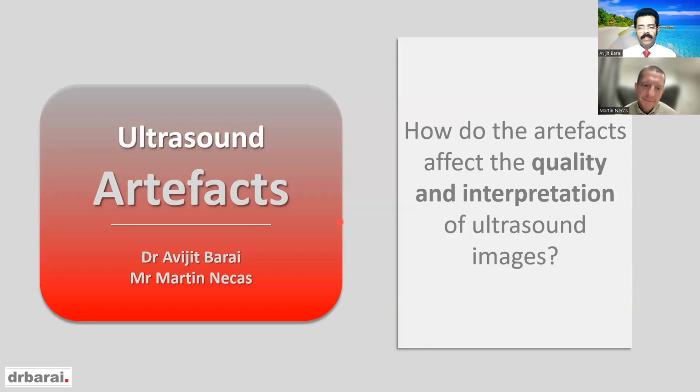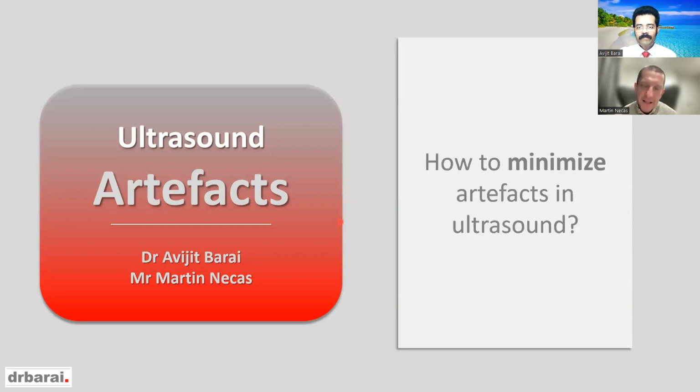So how do the artifacts affect the quality of an interpretation of ultrasound images? We have already talked about it. Most of the artifacts actually are a nuisance, but some of them are very helpful. Do you agree with that? Absolutely. Yes, I totally agree with that. And of course, we have covered some of these useful artifacts. Shadowing, to some degree, acoustic enhancement can be helpful. You've mentioned twinkle artifact. That's very helpful.